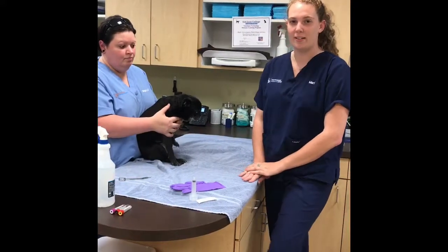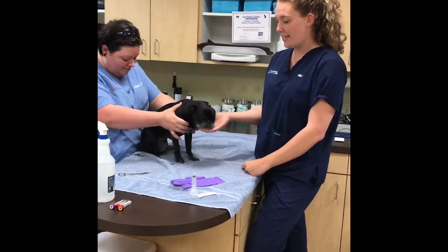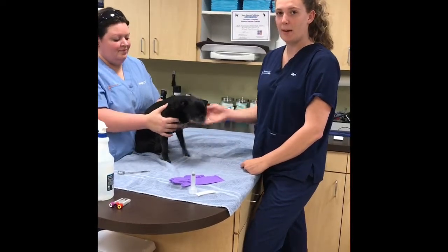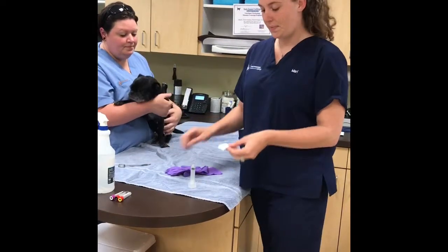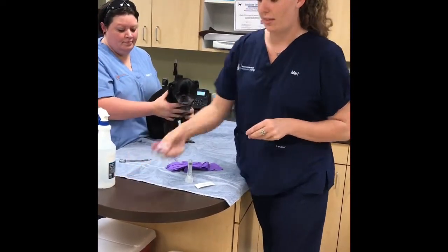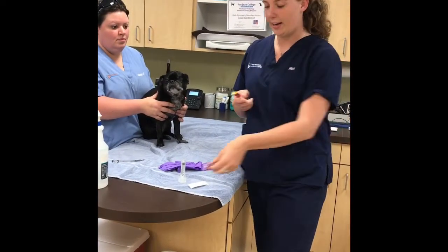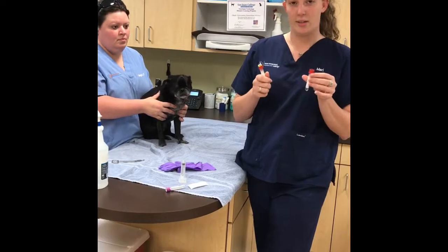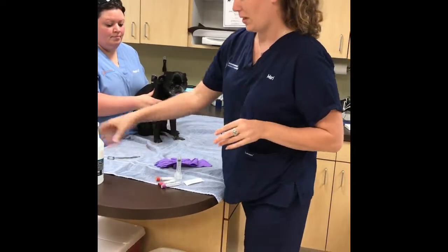Task 1, preparing serum and plasma for preoperative blood work. This is Cece. She's a 10-year-old female spayed pug weighing 5.4 kilograms. I've got my gloves here, a 22 gauge needle, a 6 cc syringe, and 3 blood tubes. So I've got my lavender top with my EDTA anticoagulant additive and 2 serum separators, plain red top and a tiger top, as well as my alcohol.